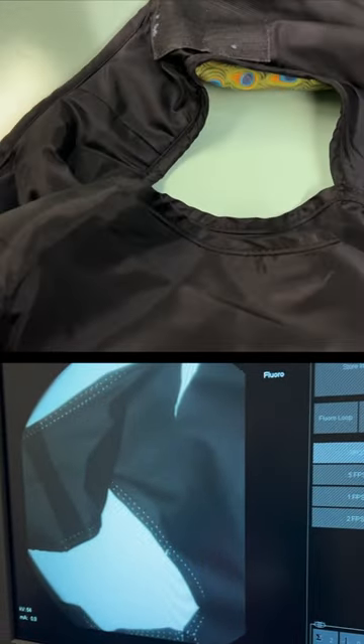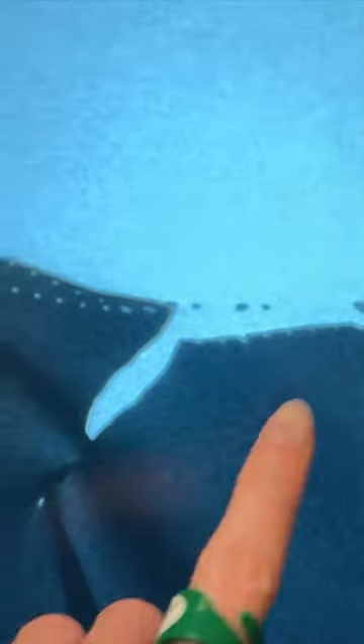This shoulder strap has been supporting the weight of the lead for years, and it's finally given up. This lead has done a good service, but this tear will only get worse, so it's time to be retired.